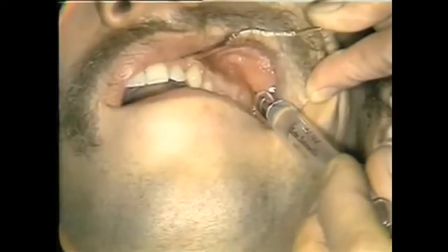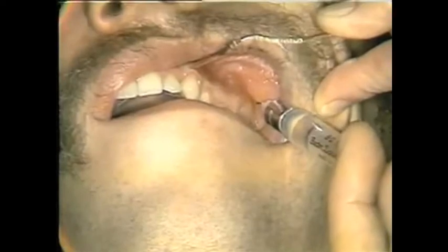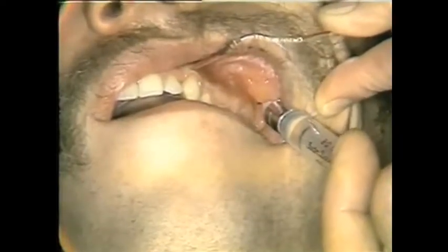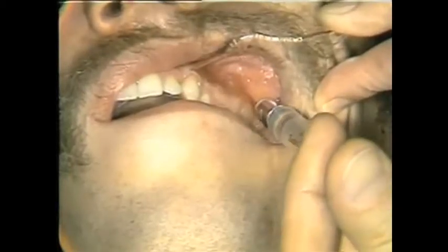All right, we'll aspirate here a little bit. We're in good position. And now we will very slowly deposit about 2 cc's of solution. And this should be adequate for the posterior superior alveolar injection.